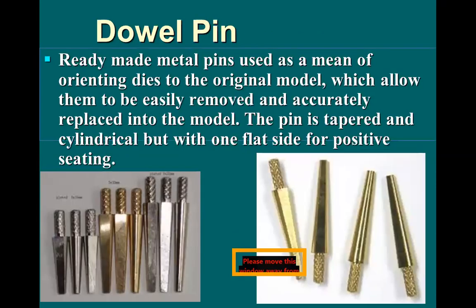الداول بن هو الأداة اللي تستخدم على شكل عمود أو على شكل رود، يكون على شكل تيبر. الراس مالته يكون محزز أو خشن حتى يساعد على تثبيت الستون عليه. النهاية مالته تيبر، حتى بسهولة نرفعه من الكاست ونرجعه في مكانه، ما يحتك كثيرا بالستون. المقطع مال النهاية يكون على شكل دائري مع مقطع فلات، من أجل أنه يمنع دوران الداي في مكانه بداخل الستون.